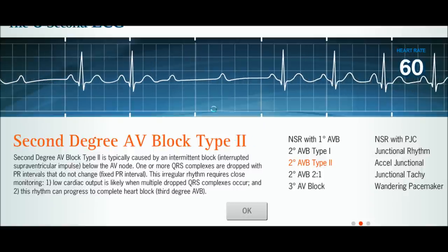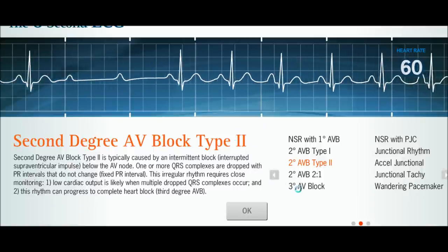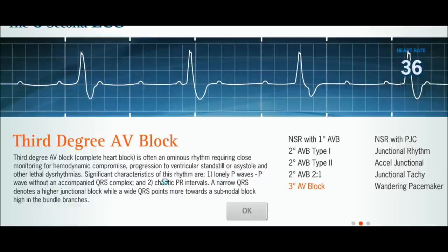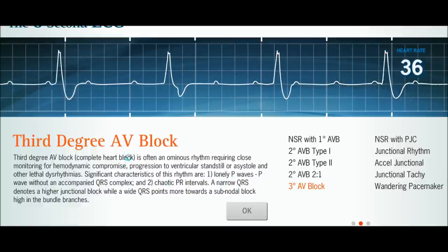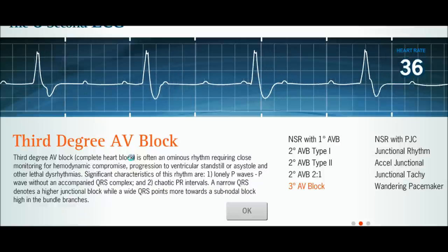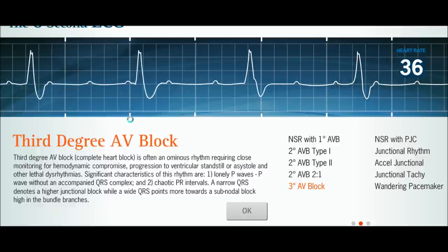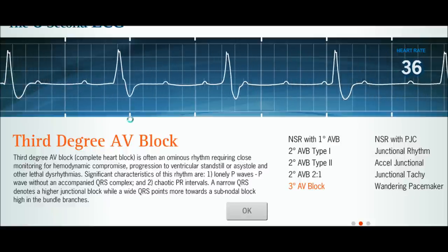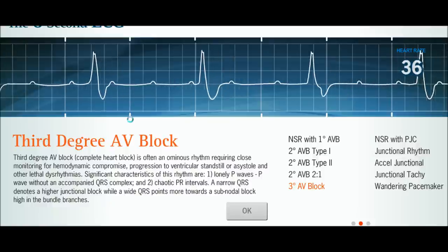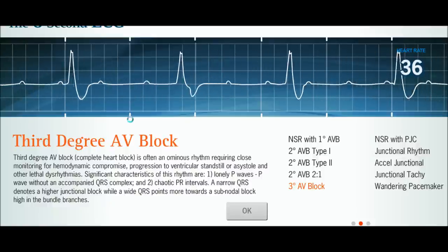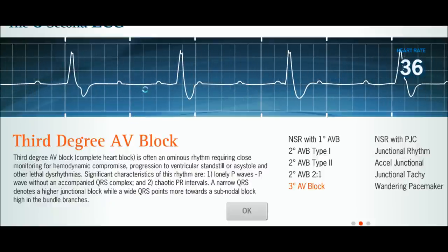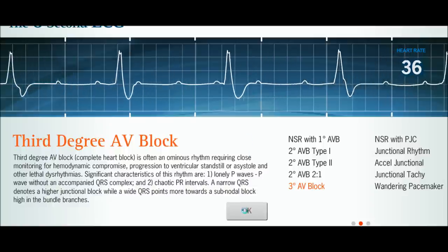Now we move to the third type of AV block, which I think is the easiest to diagnose. In a third-degree AV block, the P waves have absolutely no influence on the QRS complexes whatsoever. They're just randomly firing, and then you have random QRS firings completely independent of them. There is absolutely no pattern — it's completely random.